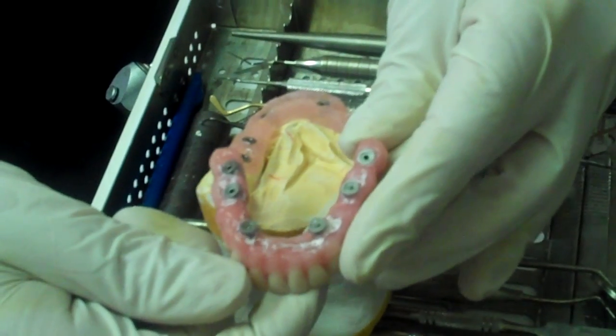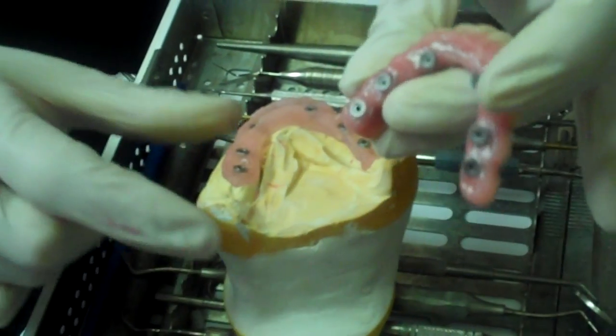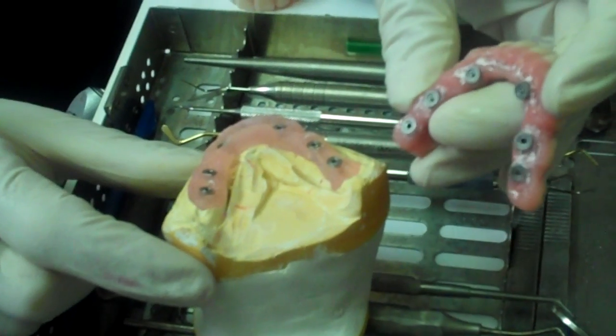Fixed hybrid denture. Six implants and a beautiful result. Here you see — I place it right on top. There it is.